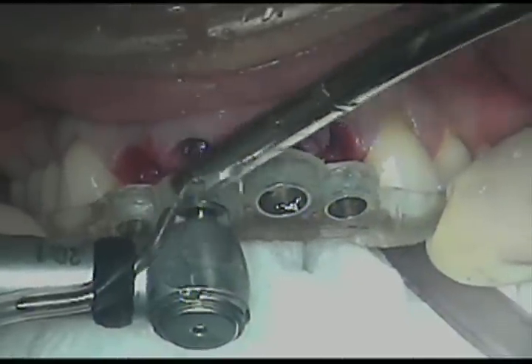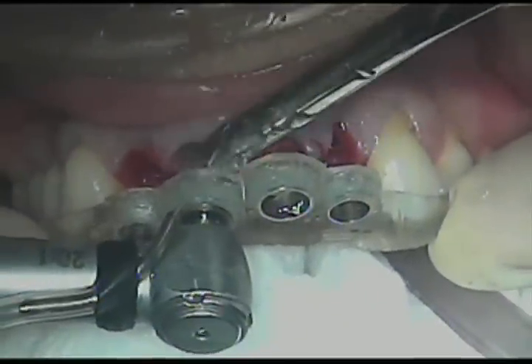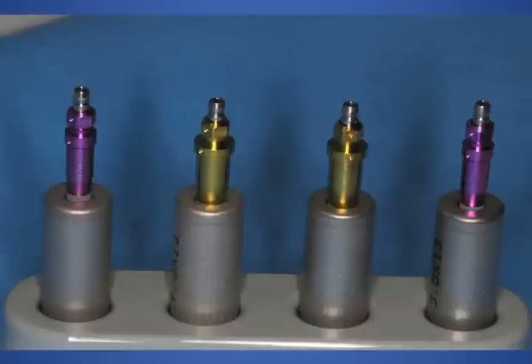We're using a 4.3 taper drill to depth. And now we're going to use longer attachments into the implant so that we can actually place the implants through the keys, through the rings that are predetermined.